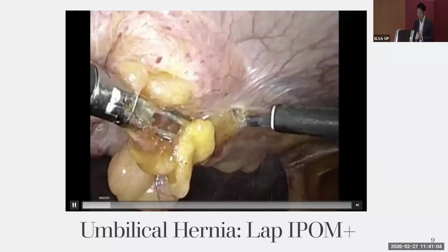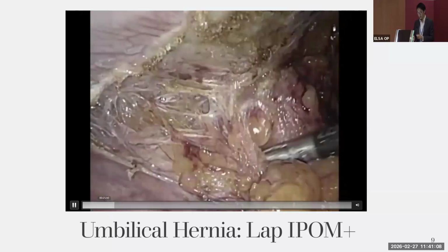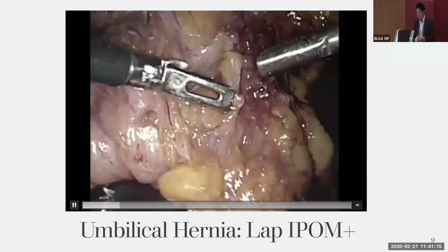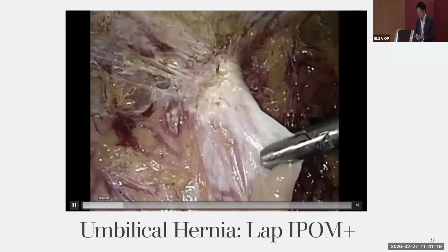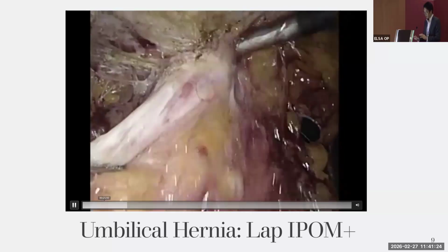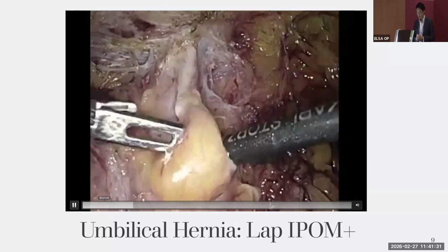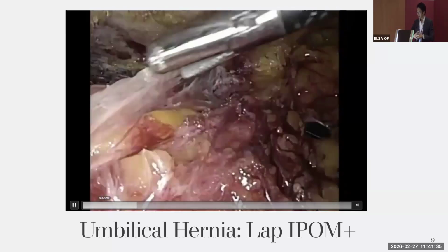abdominal entry. So you see that there's a lot of fat stuck in the anterior abdominal wall. These are all pre-peritoneal fat. So his hernia was, I think, a 60-year-old Caucasian gentleman. His hernia was filled with pre-peritoneal fat. It was not filled with any intra-abdominal organs. So you can see as we dissect around it, we use blunt dissection so that we can see clearly. We know what we are cutting, then we can use a bit of diathermy if needed. Okay, and we're fairly safe because we can see very clearly that the bowels are all down.